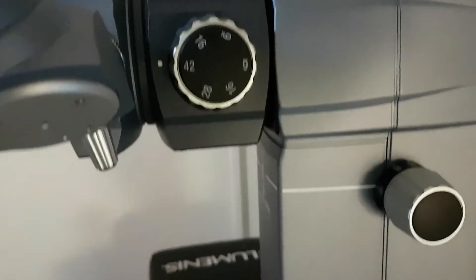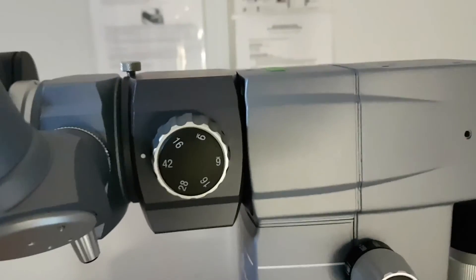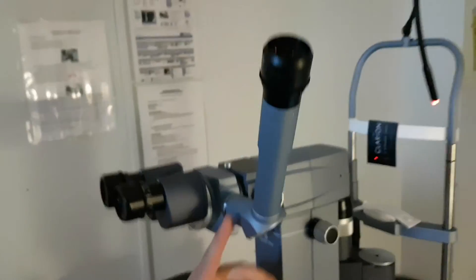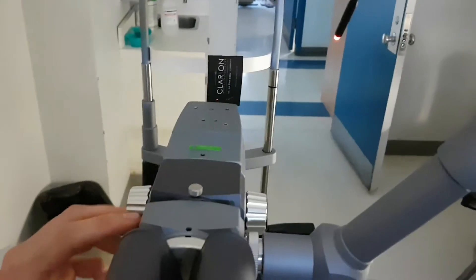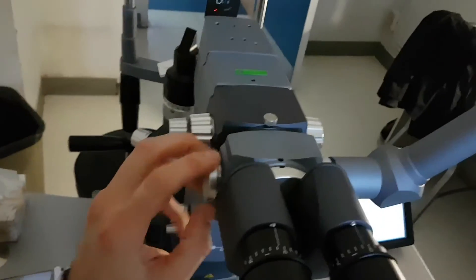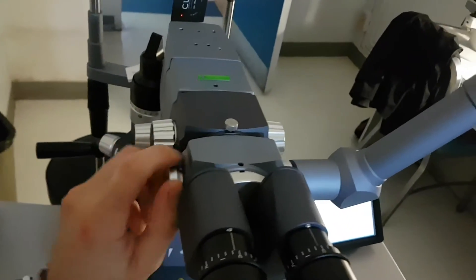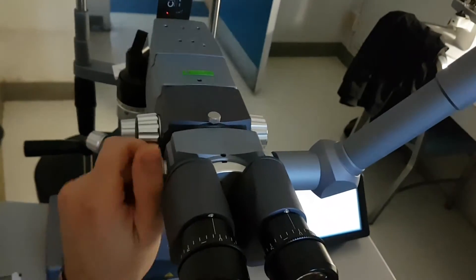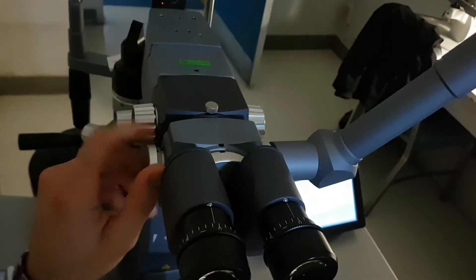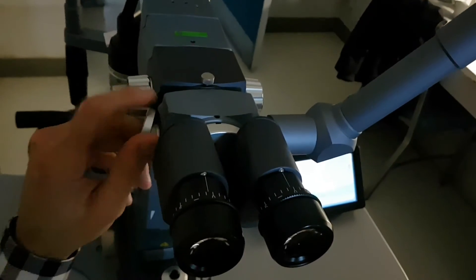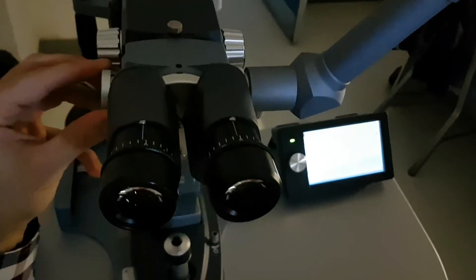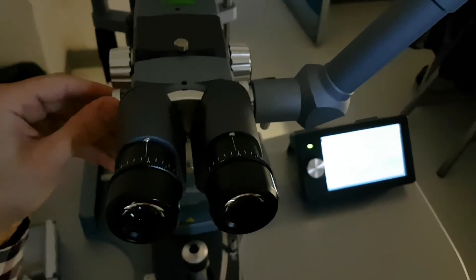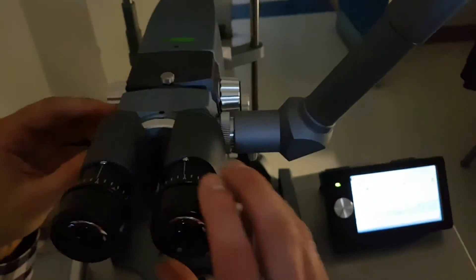If you ever have the need to change the co-observation tube from one side to another, ask biomedical. But it is possible to put the co-observation tube on the other side of the beam splitter.